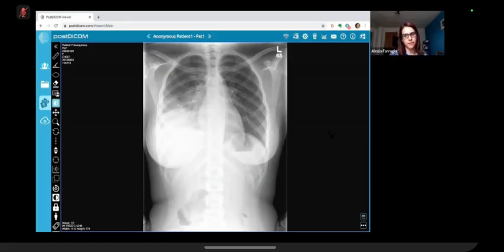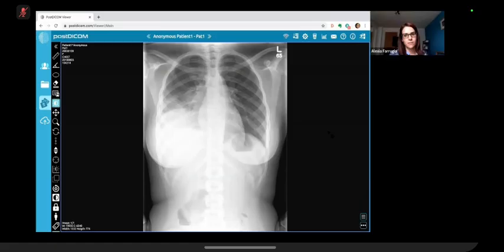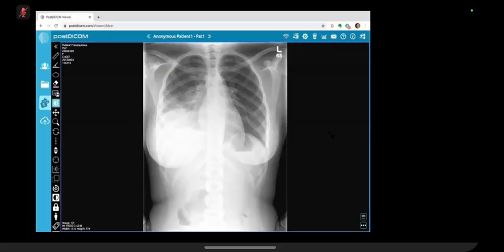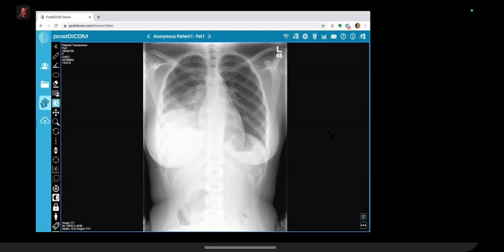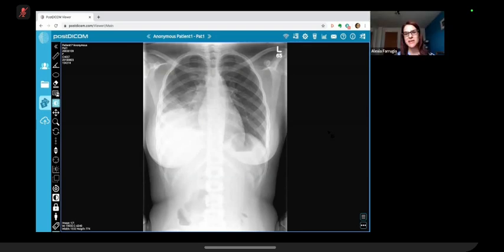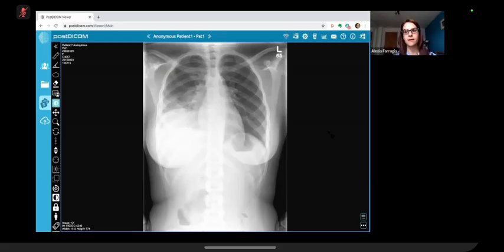Septic. It's a right lower pneumonia, given the pleuritic pain and the fact that she's septic. Oh, I did not know she was septic. I thought it was just pain. No, I told you she's septic after that. She presented initially with chest wall pain, and eventually she became septic.